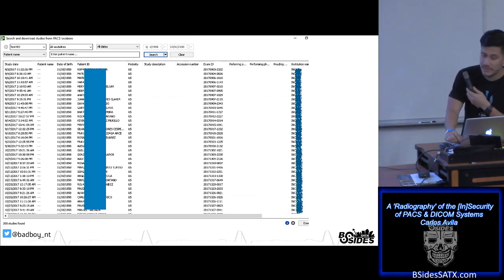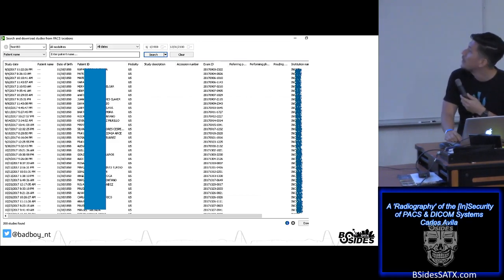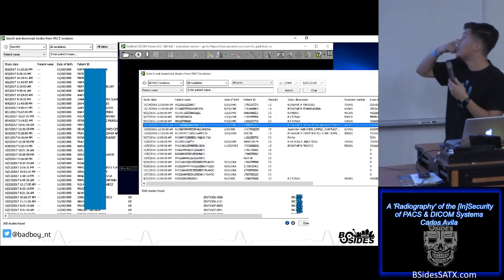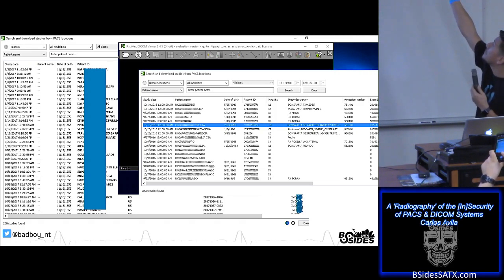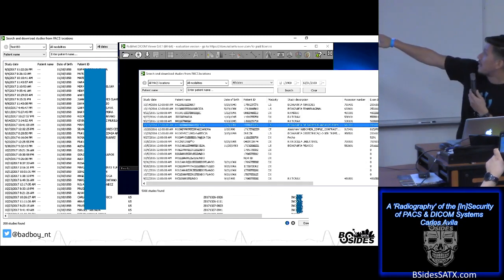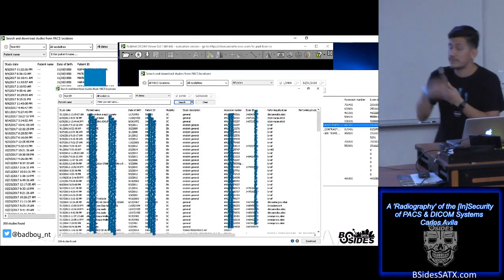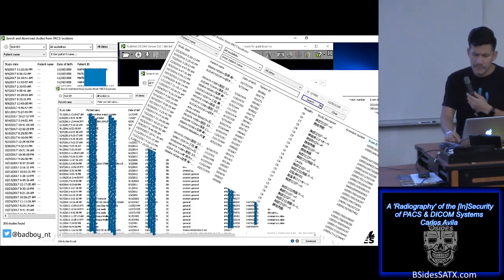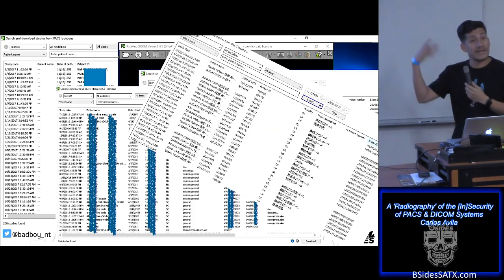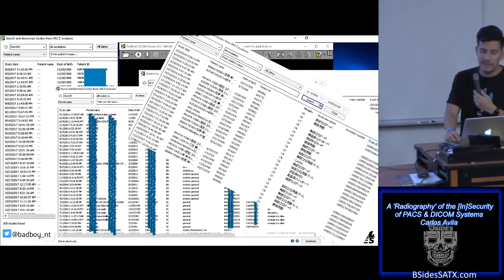These are other servers exposing patient information. For example, in this case is a test on a server in Bolivia. You have 200 studies or records of patients. In this case, in Ecuador, you can see the names, for example the study day, names, date of birth, type of study, description, etc. In this case, it's 500 studies or records. This is in Brazil, for example, another server exposed on internet, and another example is in Japan. With this type of simple vulnerabilities, in some countries several companies have been indicted with millions of dollars in fines.